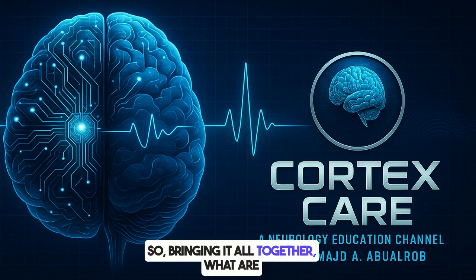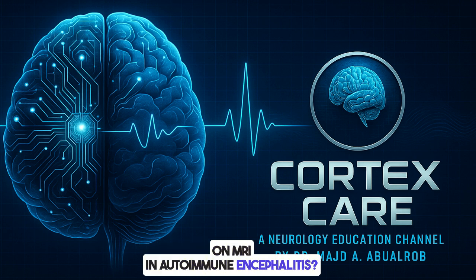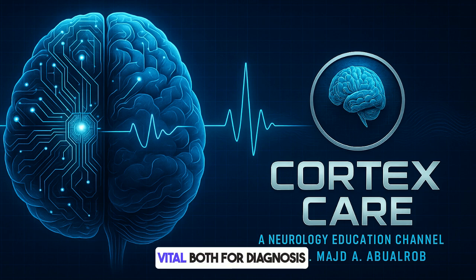So bringing it all together, what are the main conclusions from this review on MRI in autoimmune encephalitis? Well, I think it really underscores the complexity, the heterogeneity of these conditions, but also there are shared patterns, especially that limbic encephalitis picture we saw recurring. Right. MRI is clearly absolutely vital, both for diagnosis and potentially for prognosis. Even though it can be normal sometimes. Exactly. And while some AEs have pretty nonspecific lesions, others, like GFAP with that radial enhancement, have more characteristic patterns that really help clinch the diagnosis or rule out other possibilities.